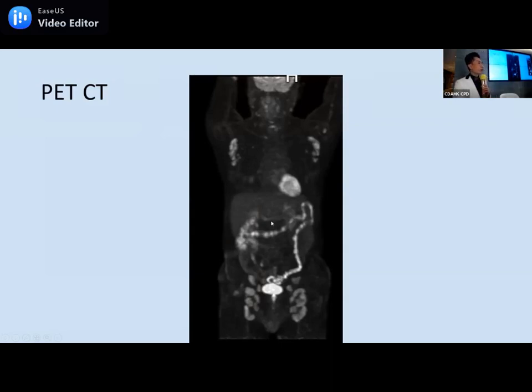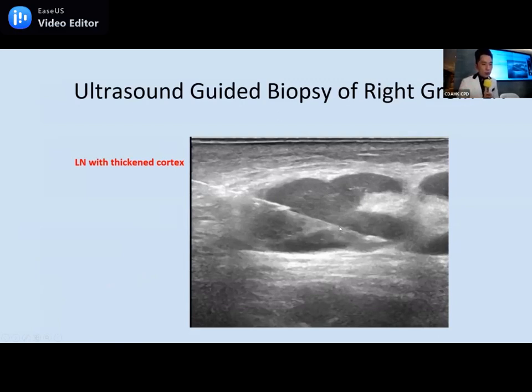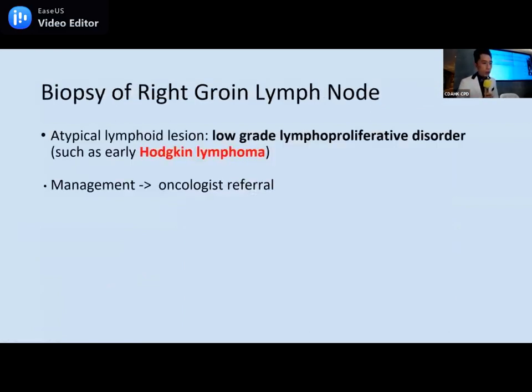To confirm lymphoma, we suggested a biopsy under ultrasound guidance. These lymph nodes are irregular with thickened cortex, but the shape is preserved — which speaks for lymphomatous disease rather than metastasis into the lymph node, since the architecture is preserved. Histology came back as an atypical lymphoid lesion, possibly early Hodgkin lymphoma or low-grade lymphoproliferative disorder. The patient would be referred to the oncologist.